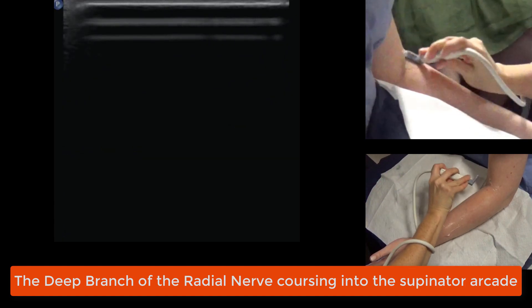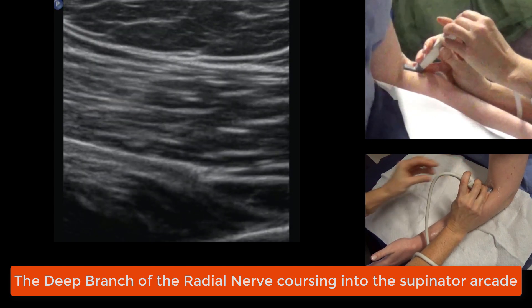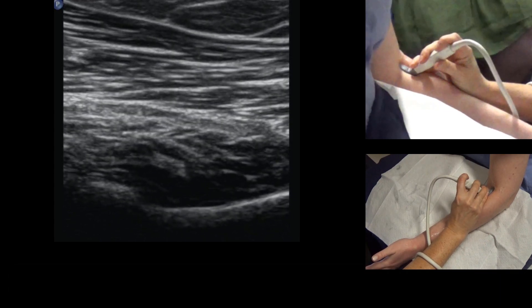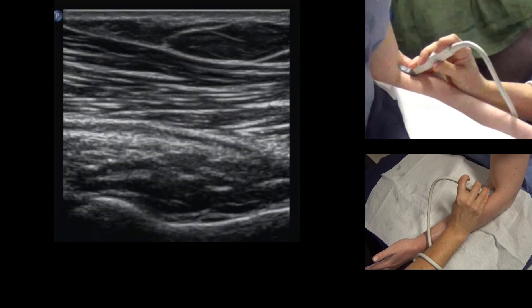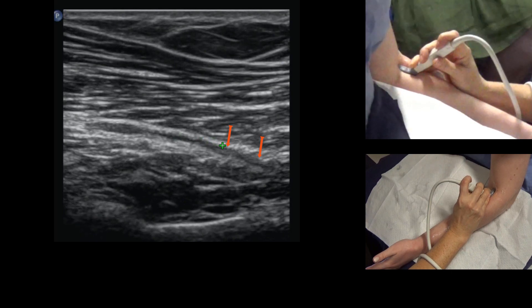You need to sweep in from the anterior side. So if I find it in transverse, now I'm going to rotate into long. The nerve should have a really quite uniform straight course — it shouldn't look fat and then kink as it passes into the muscle. Here it is before it's in the supinator, and here it is passing into the supinator.